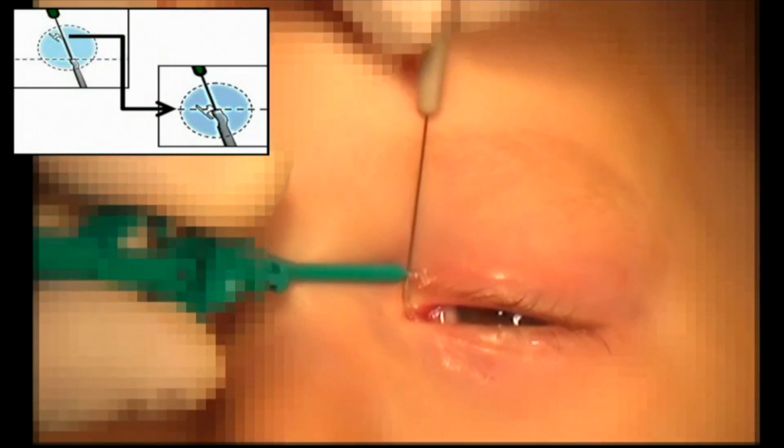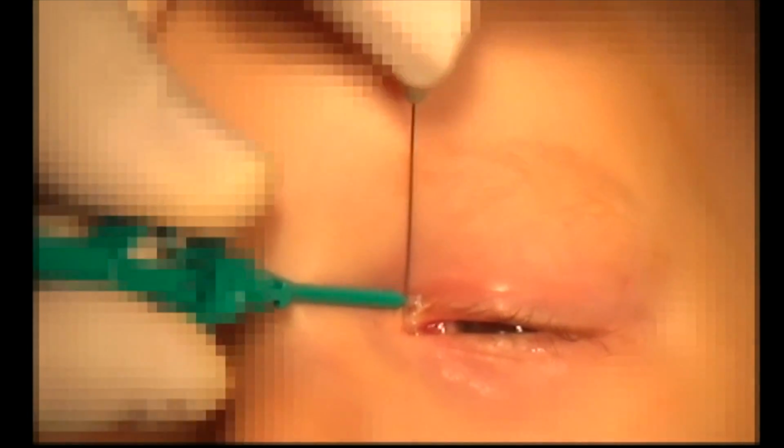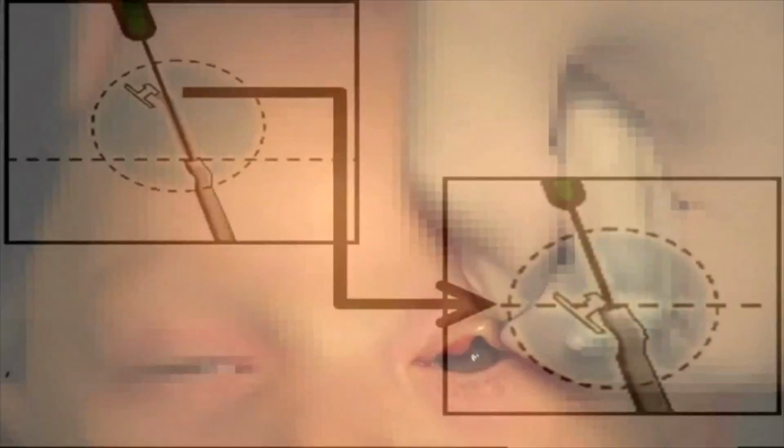By holding the fixation plug firmly against the punctum and carefully withdrawing the metal guide 1 to 2 millimeters, the silicone sleeve can be guided further into the canaliculus by a similar amount. This process can be repeated several times until the fixation head reaches the punctum. However, if there is any risk for premature expulsion because the stent still appears too long, then this MASTERKA stent should be removed and the procedure repeated with a shorter one.